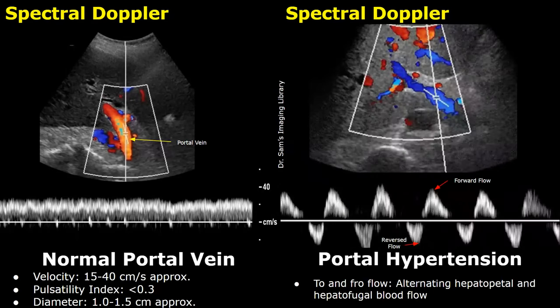In some cases of portal hypertension we may find to-and-fro flow, which is an alternating forward and reversed flow. We will get a biphasic waveform on spectral Doppler consisting of forward flow and flow reversal. This is a combination of alternating hepatopetal and hepatofugal blood flow and can be seen in severe cases of portal hypertension.